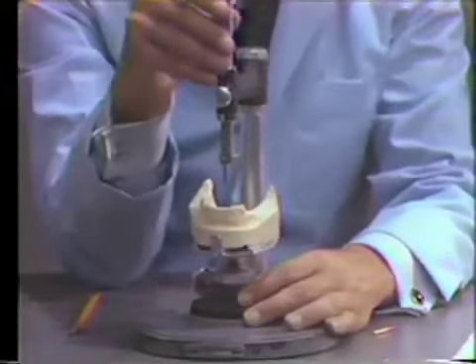Tripoding is merely taking 3 points which are unlikely to change on another impression of the same mouth and marking them in one plane so that I can take another cast of the same mouth and reposition it on the surveyor in the same position.